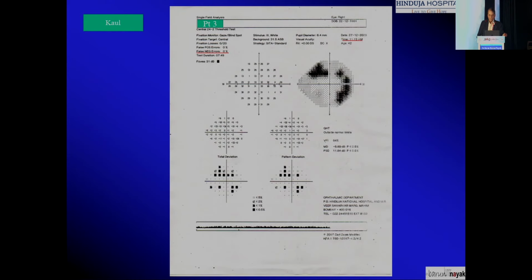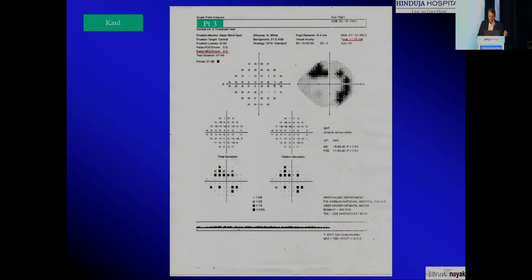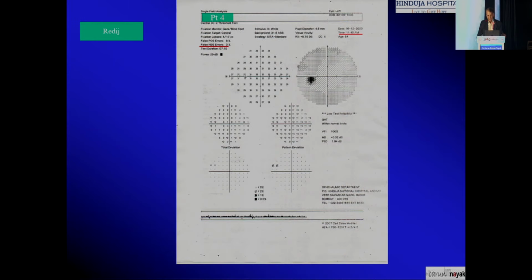This defect is not really correlating clinically; though sometimes, if photocoagulation has been done properly, you may see that. But again, after proper explanation, this was the field, the same day, after some time. I don't have an explanation why the patient responded like that the first time.